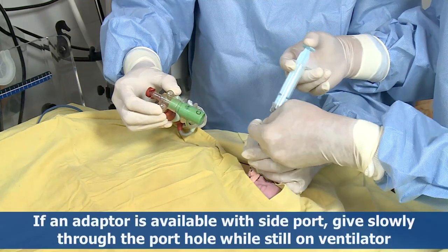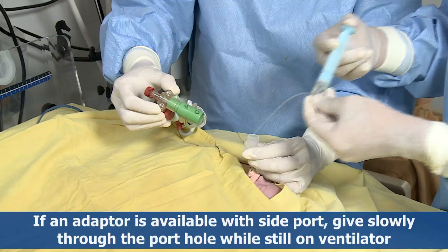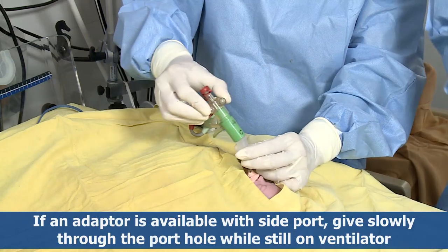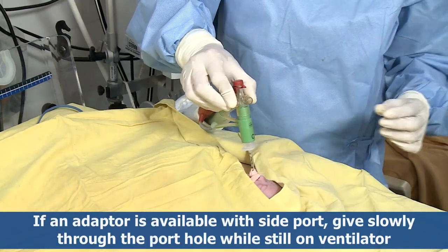If an adapter is available with a side port, give the surfactant slowly through the porthole while the baby is still on the ventilator.